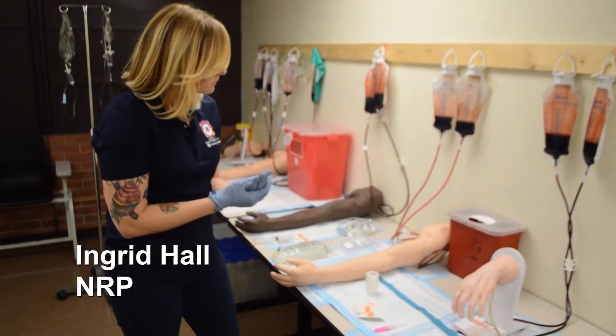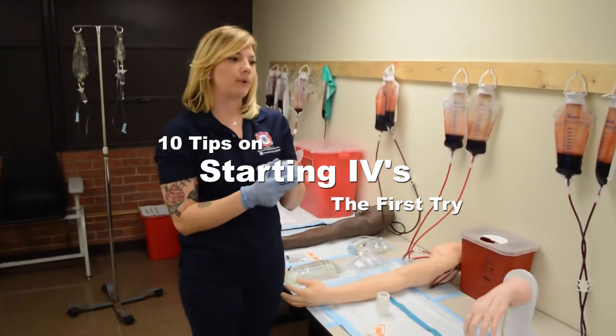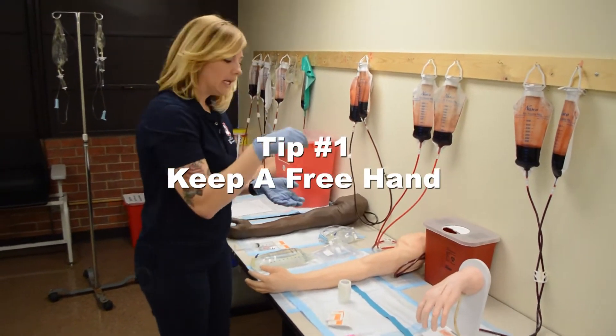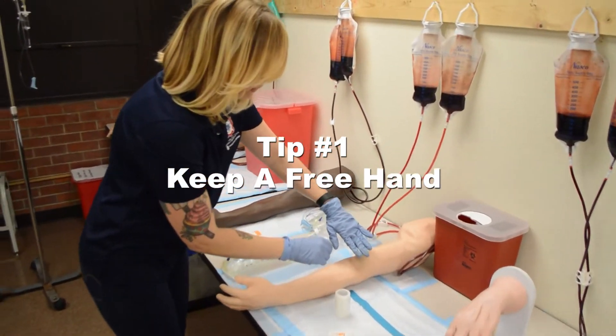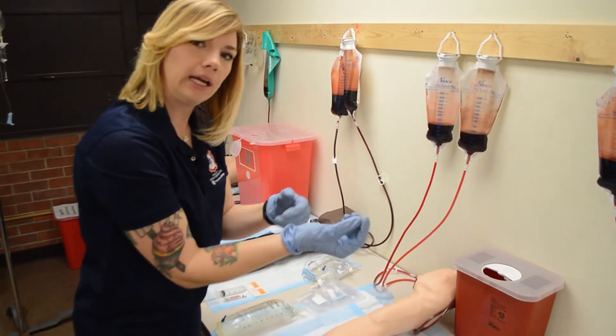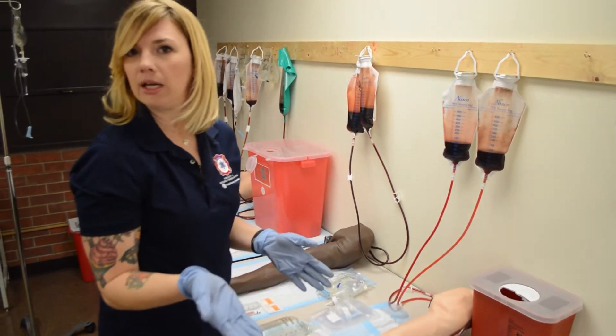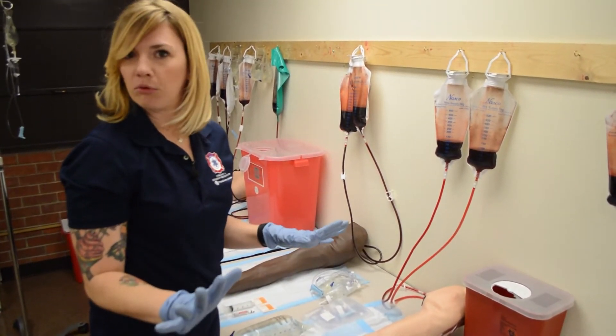What I like to think of is my opposite hand is like my guiding arrow. So if I'm in the skin and I'm having trouble finding my vein again, this hand is free. You always want to have a working hand and a free hand if possible. As medics, we learn over time you only have one hand ever, so you've got to do what you can with what you've got.